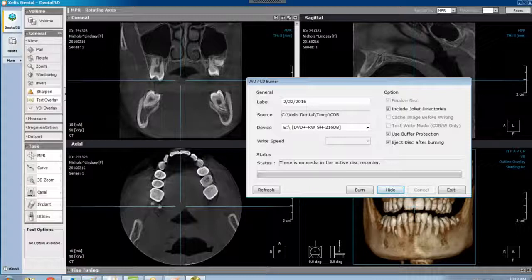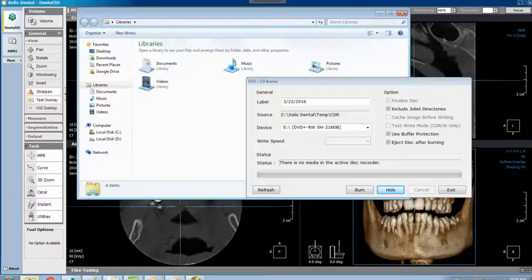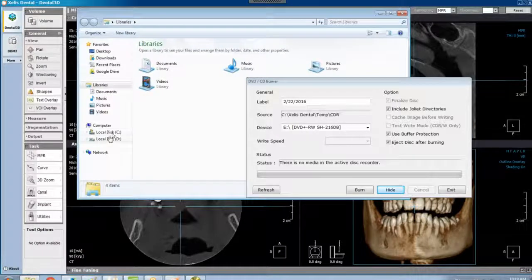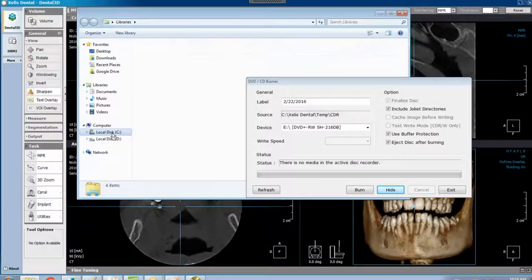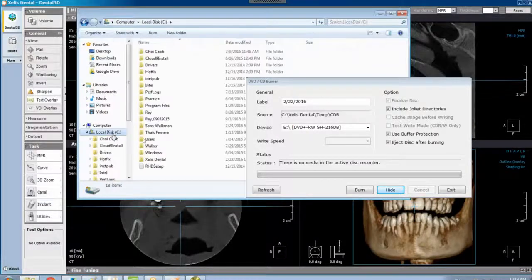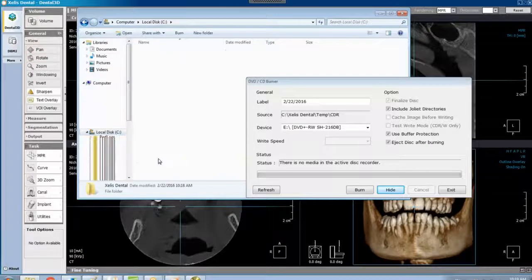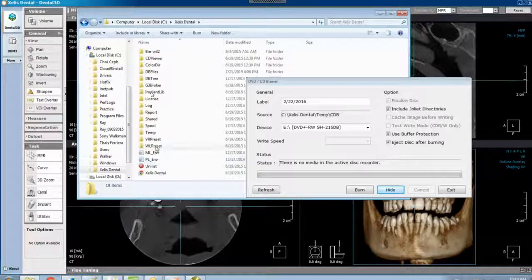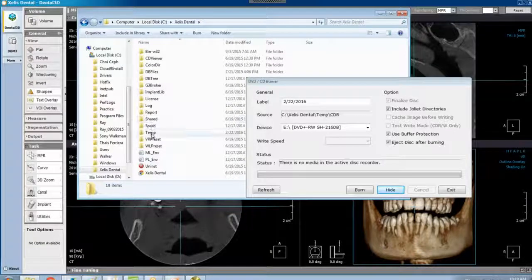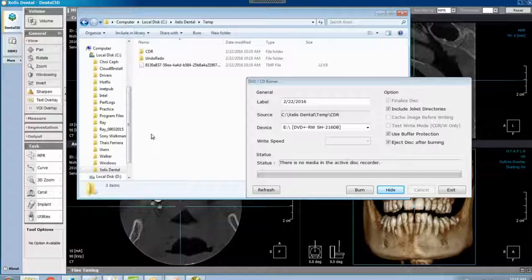You're going to go to your libraries and find your C drive, Zealous Dental, double clicking on that, double clicking on Temp.